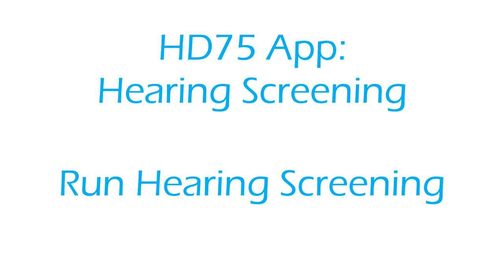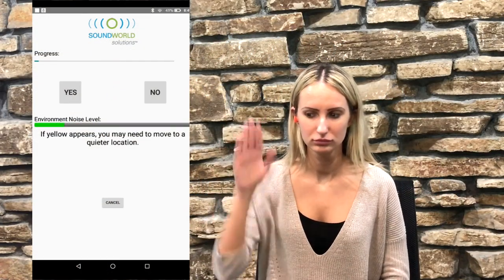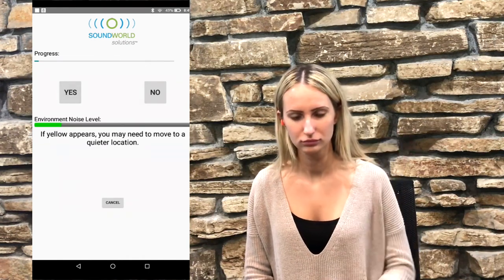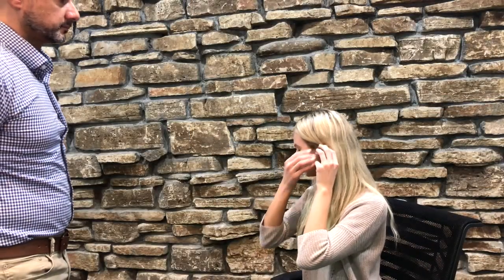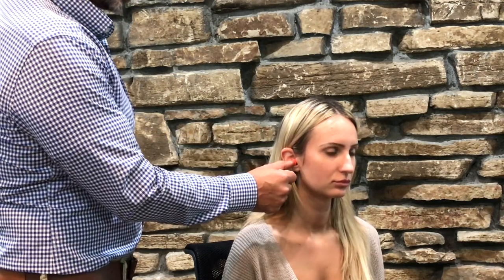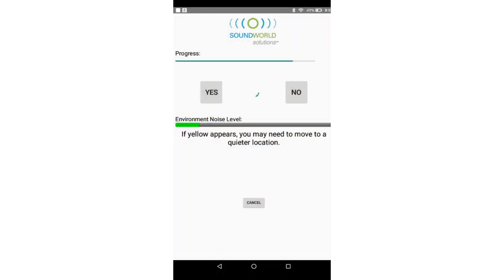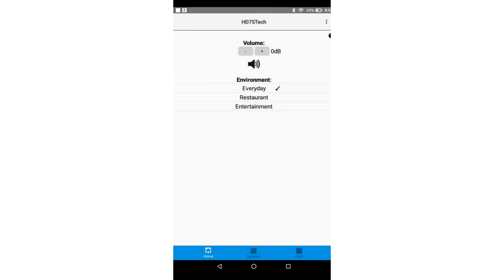Run hearing screening. Instruct the patient that he or she will hear many beeps. Every time they hear a beep — even if it is a soft beep and they just barely hear it — they should raise their hand to let you know they heard it. Insert the HD75 hearing device in the test ear and the phone plug into the non-test ear. Make sure you are in a quiet setting to avoid noise interference. At the end of the hearing screening, press OK to have the software automatically program the hearing device to the patient's hearing results.